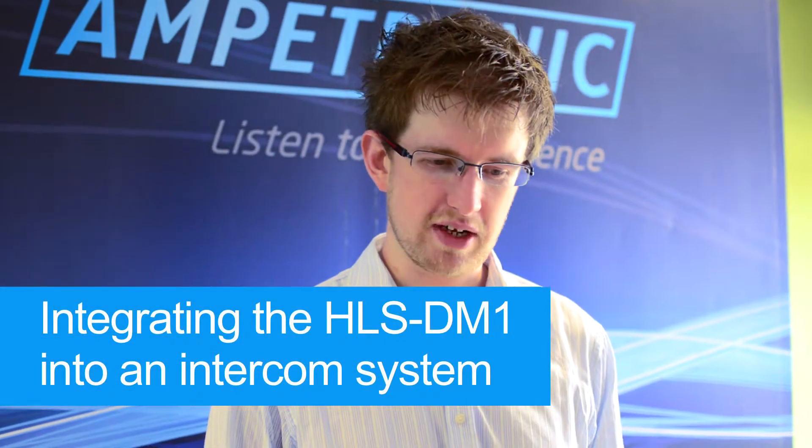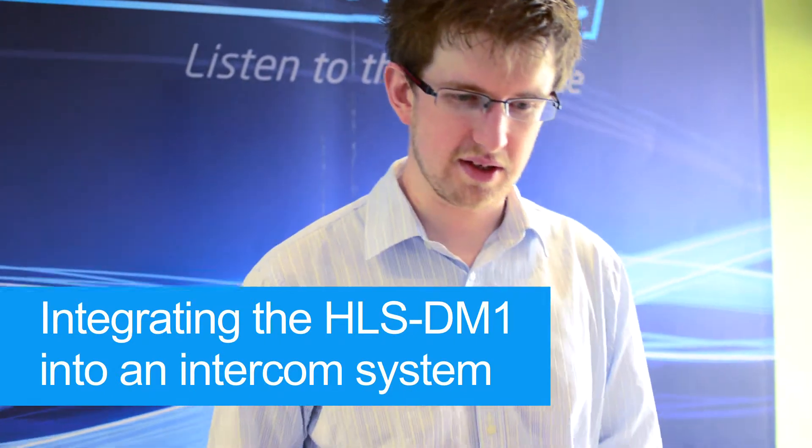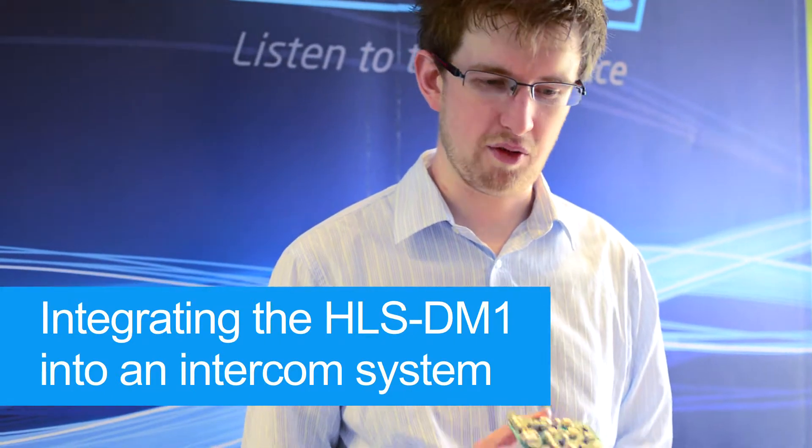Hi, I'm Rowan. I'm a development engineer at TemperTronic, and this is going to be a simple demonstration about how easy it is to integrate the driver module from our new hearing loop system into a regular intercom enclosure.